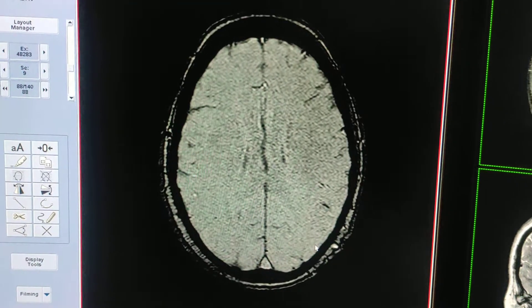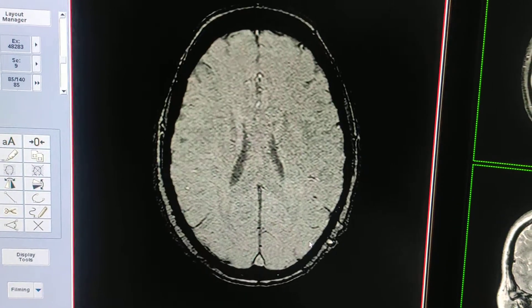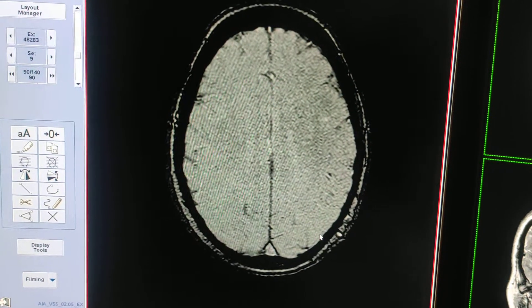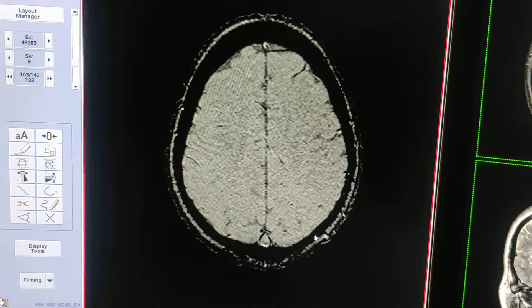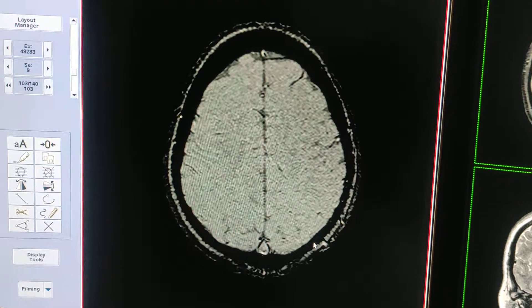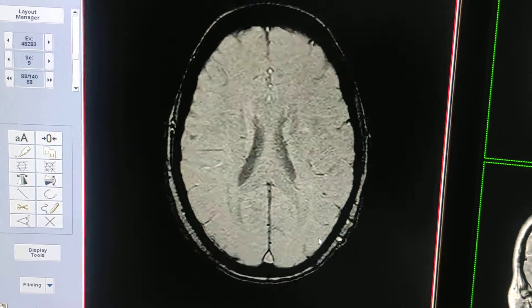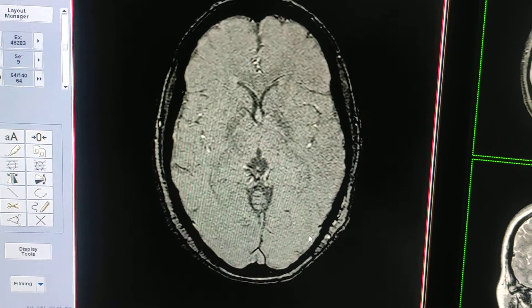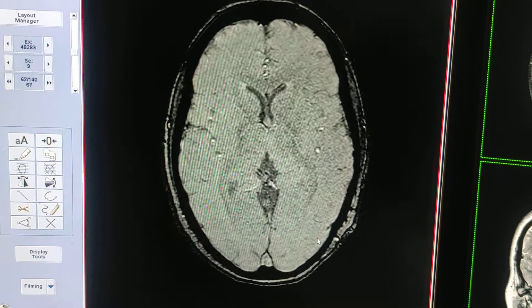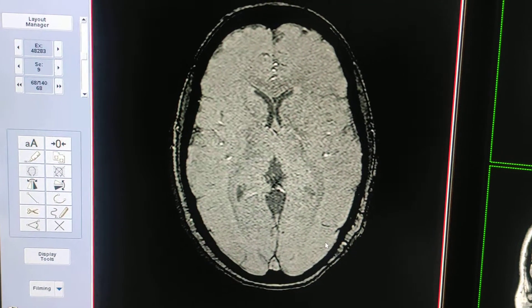This sequence is mainly used to detect micro hemorrhages, calcifications, or iron depositions. In many cases you can use this sequence — for example, for vascular malformation, and second for cerebral infarcts, in which you can differentiate whether it's a hemorrhagic or non-hemorrhagic infarct. It is also used for traumatic brain injury to rule out micro hemorrhages.